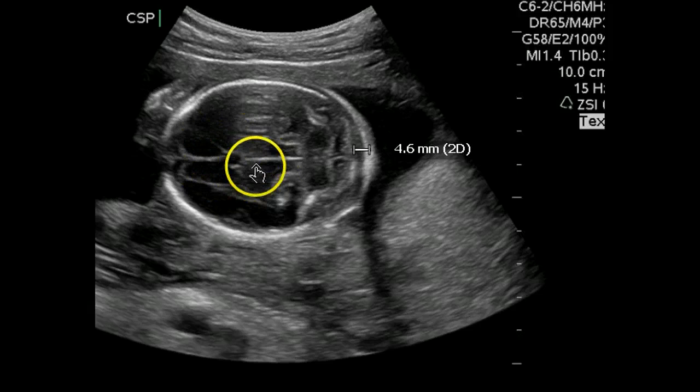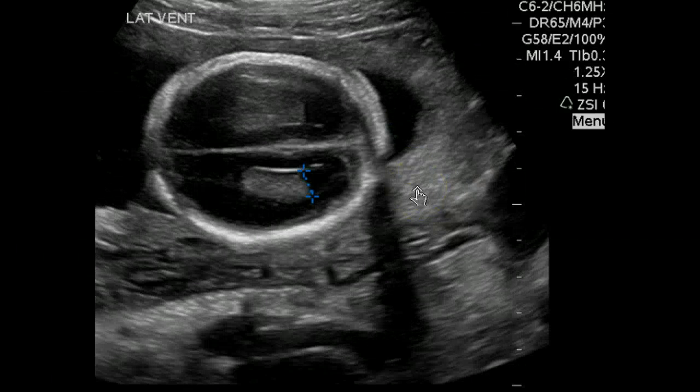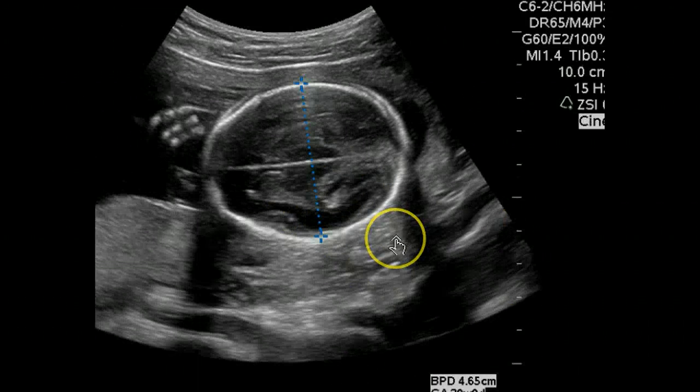And this is actually the perfect plane to measure CSP here, thalamus, and the cerebellum. Here's an even better measurement. We could measure it again if we're really wanting to get aggressive. Still around 4.9. So it's less than 5. We're happy. The lateral ventricle, the choroid's filling it, so we don't even need to make a measurement, but when we do, it's normal.